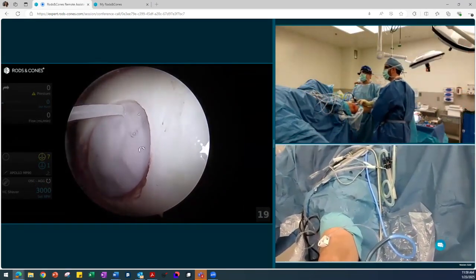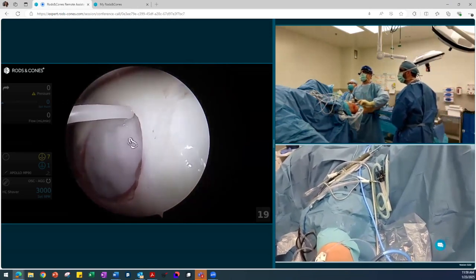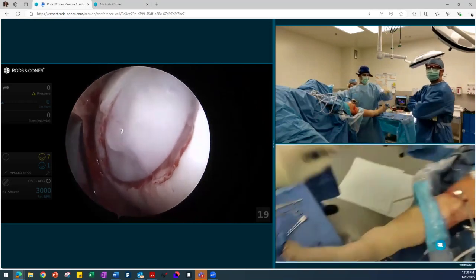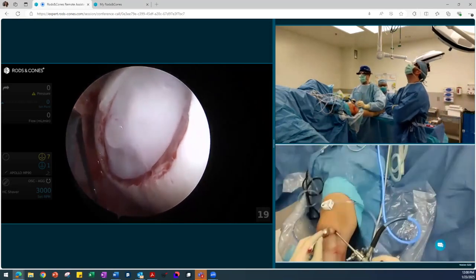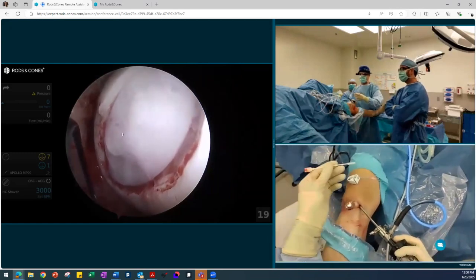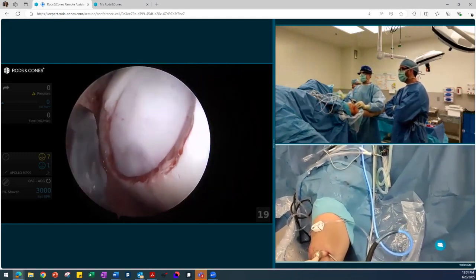After this is complete, you can see here we start from the top. Again, gravity will bring the Tisseel down, and you want to coat this well enough that there's no fluid leakage. If you need to do any adjustments, again, that plastic tip works quite well, and you can see here we're taking out any more air bubbles from this area and making sure that it's appropriately coated on all sides.